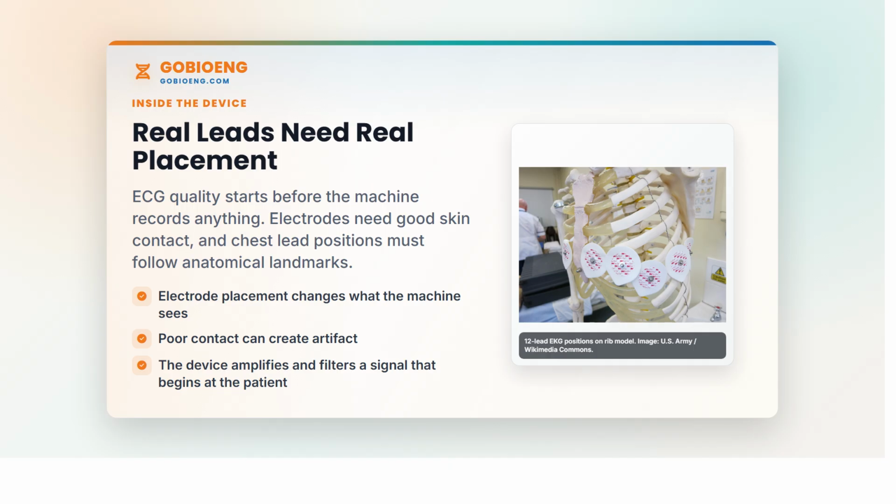A standard ECG captures a short time window, but many rhythm problems are intermittent. This is why Holter monitoring and ambulatory ECG became important. These systems record heart rhythm over longer periods, while the person continues daily activity.